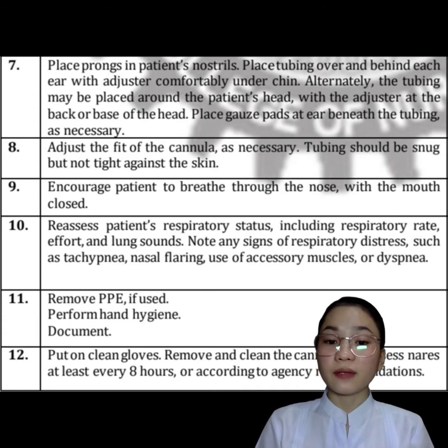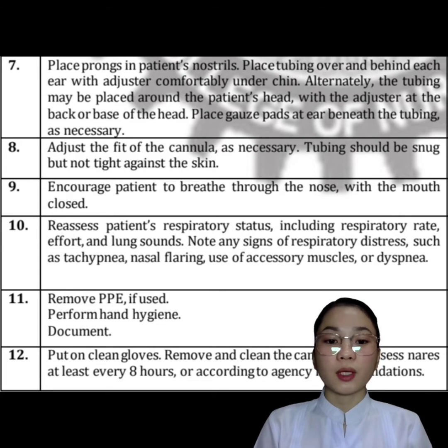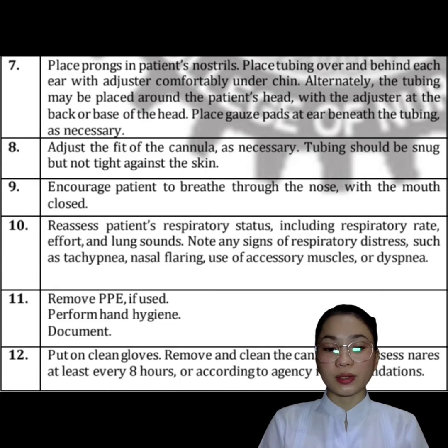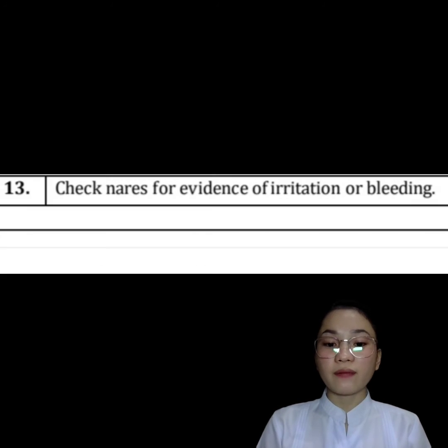Remove PPE if used. Perform hand hygiene. Document. Put on clean gloves. Remove and clean the cannula and assess nares at least every 8 hours or according to agency recommendations. Check nares for evidence of irritation or bleeding. So let's start.